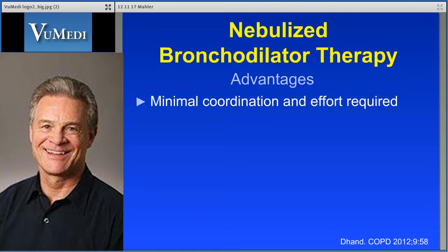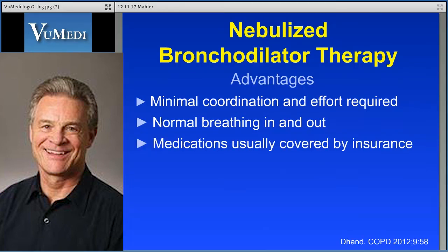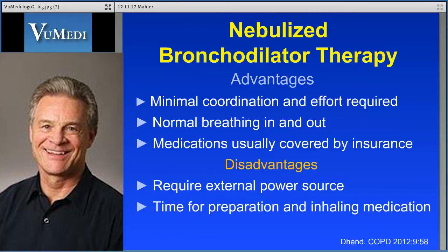There's normal breathing in and out, and medications are usually covered by insurance. The disadvantages of this approach are an external power source is required. There is time for preparation and inhaling the medication, and fewer medications are currently available for nebulized therapy than by the three other delivery systems.